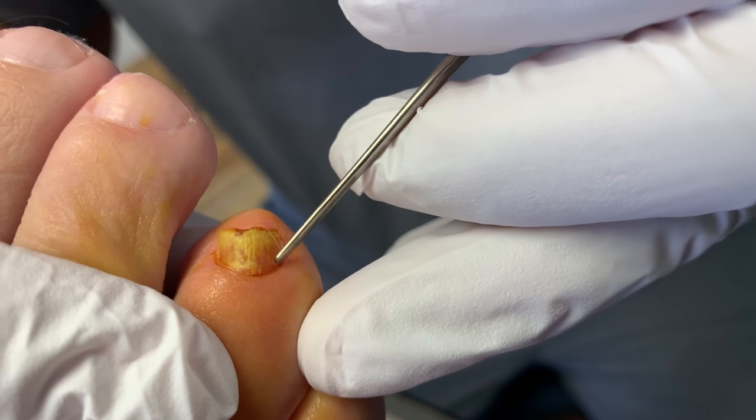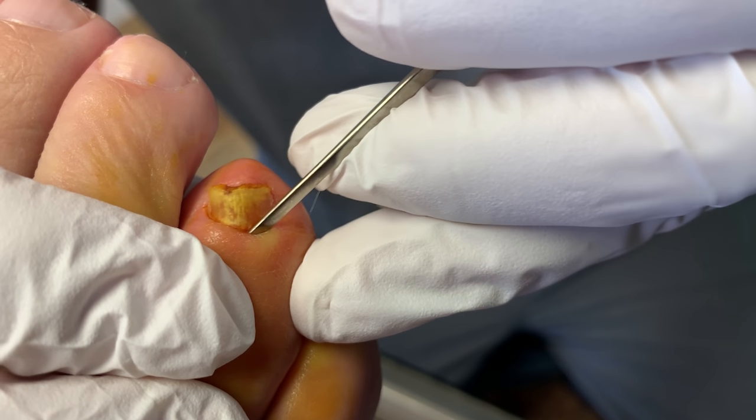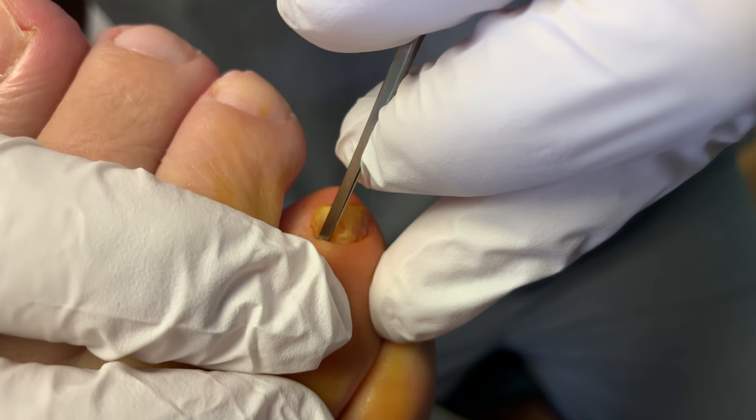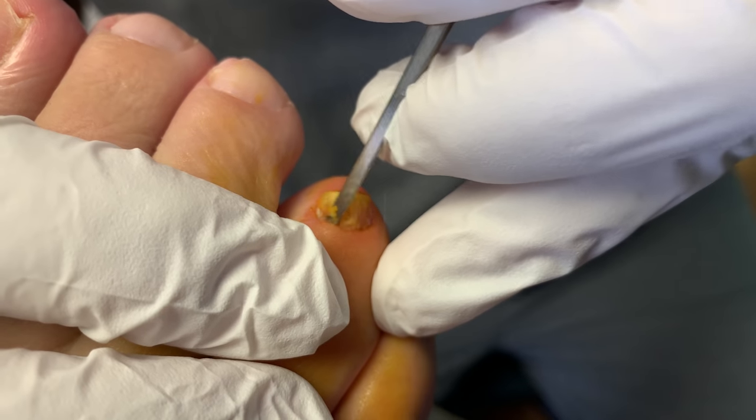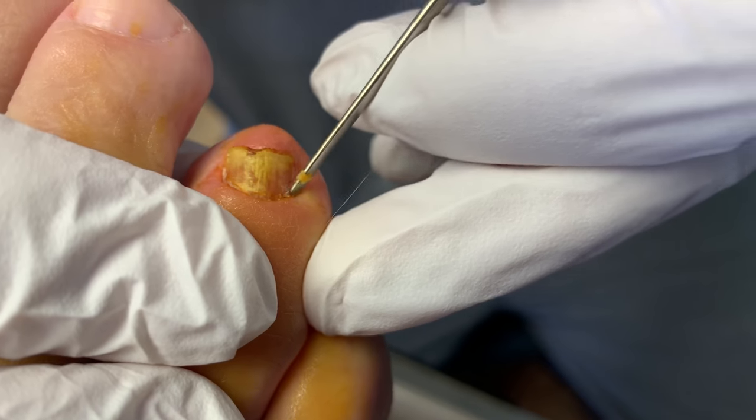Again, the same procedure we do with all the ingrown toenails and nail avulsions. We loosen up the skin around the toenail ever so nicely. We try to make this as atraumatic as possible. No pain, right? No pain.